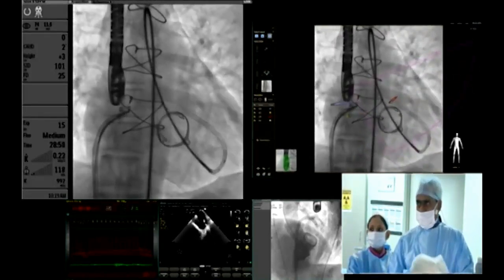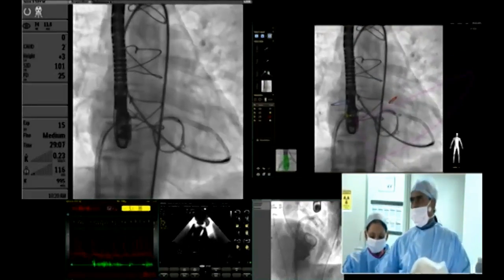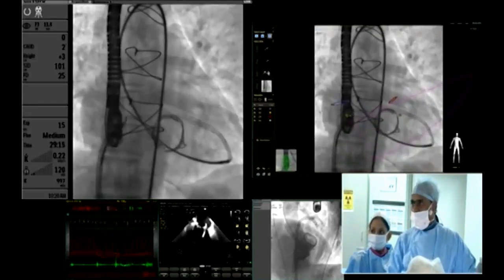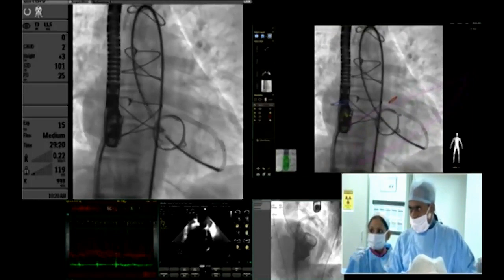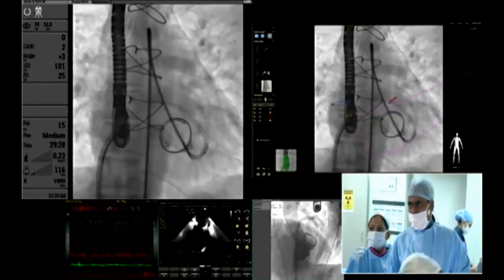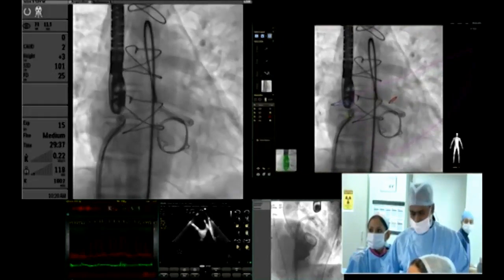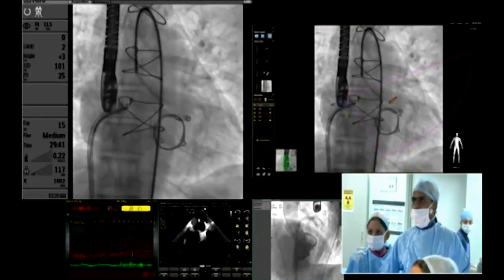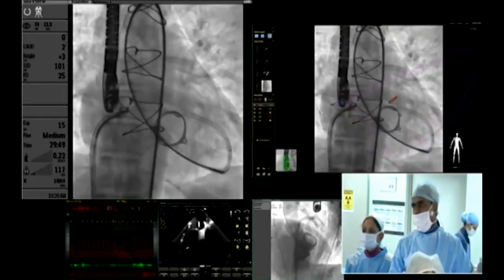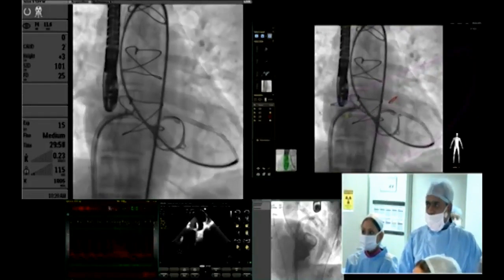Now, watch it — the shuttle sheath is already caught with the snare, because many times when you are struggling with a kinked sheath and trying to pass the plug or any device, they can flap back or whip back into the LV and you lose access. To prevent losing access, keep the tip of the shuttle sheath snared into the LA. The shuttle has a sharper kink at that particular point.